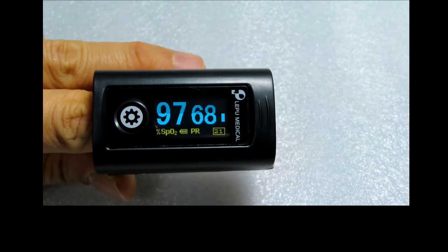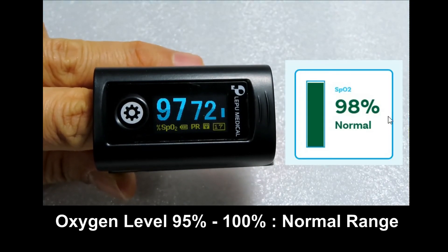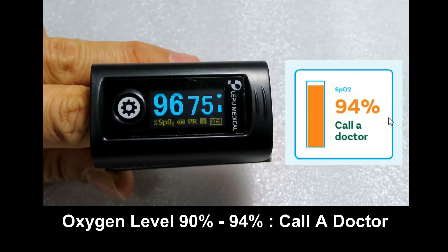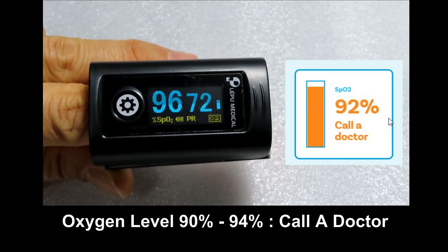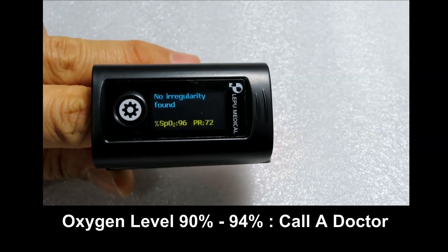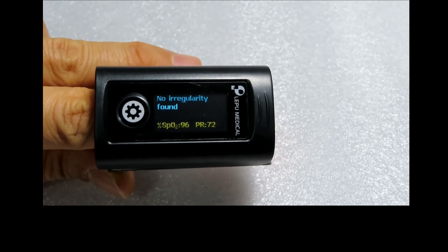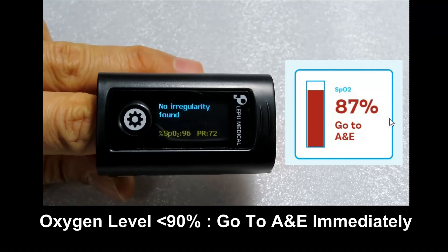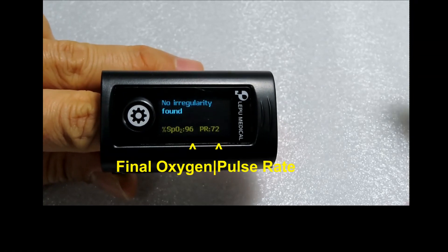Do take note: between 95 to 100% is the normal range for your oxygen level. If it drops to 90 to 94%, you need to call a doctor because you need more oxygen. And if it drops below 90%, you need to go to an A&E immediately because you need oxygen urgently.